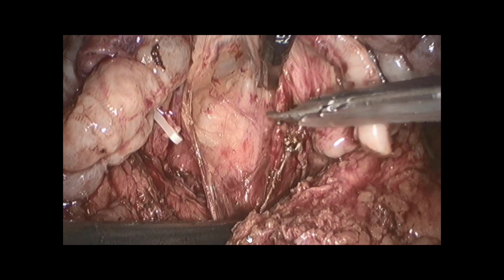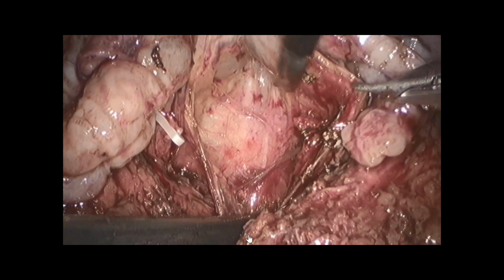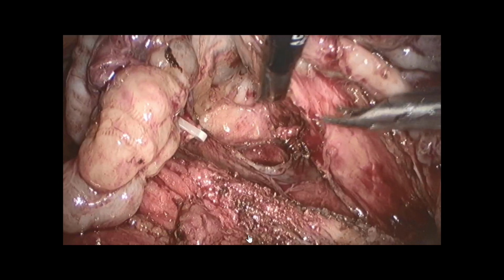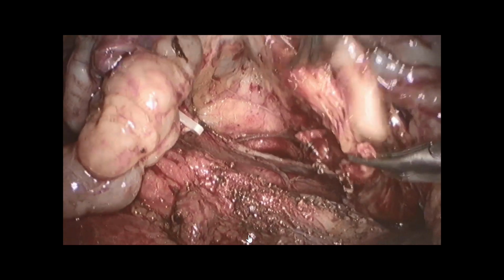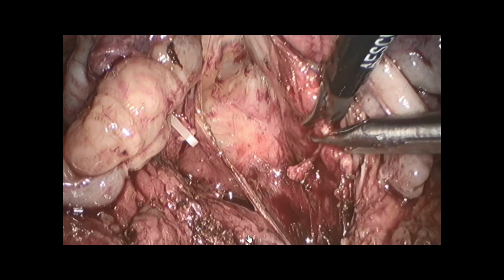And you see my mini clip, as I use it, it's like a grasper. You can grab something, and when you think it's okay, you can place a clip. It's really effective. And you just enlarge on both sides, and now it's time to start the nerve sparing.